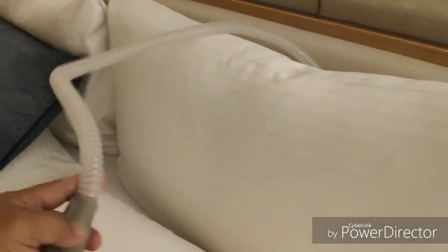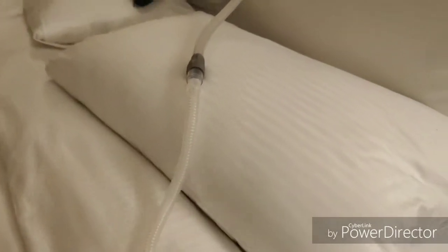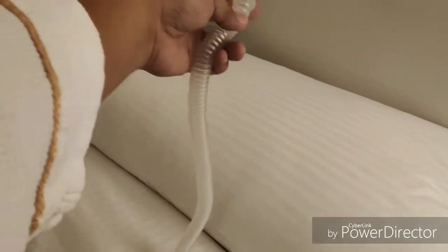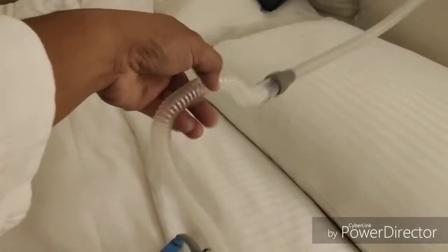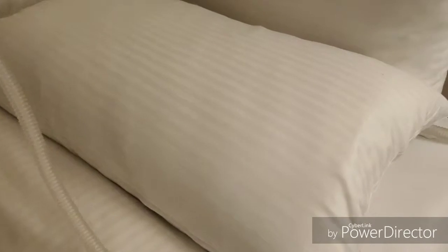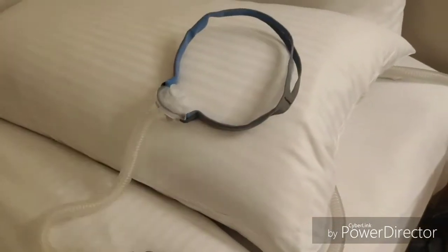Now, when it comes to tubing, if you are using a full face or a nasal mask, you can do the setup where the hose goes up on top of the pillow and then you have the mask attached to the hose on top of your head. However, since I'm using a nasal pillow mask, since it has an additional soft tubing short with it, it's hard to do that because if you have this on top of your head, this additional tubing that's already attached to the mask will collapse on your face. Therefore, it's better to just put it towards the side. And whichever side you sleep on, make sure that you have enough slack for when you put this on your face. And if you turn to your left or right side, you'll not pull on the mask and create some leak.